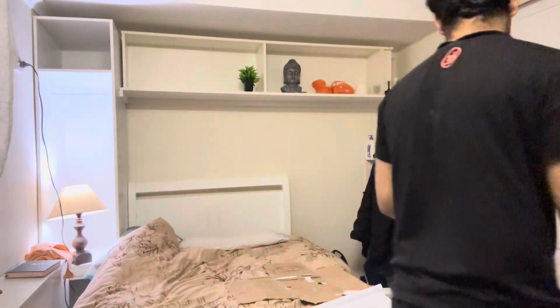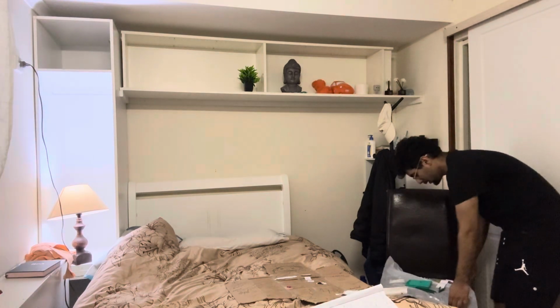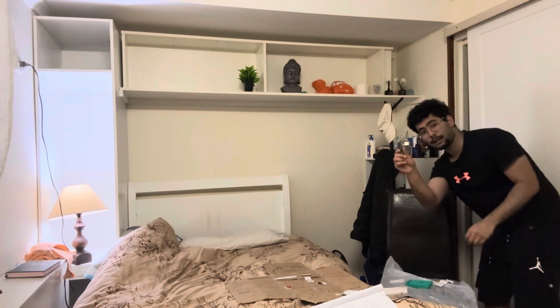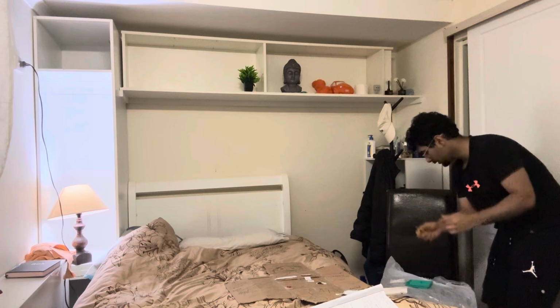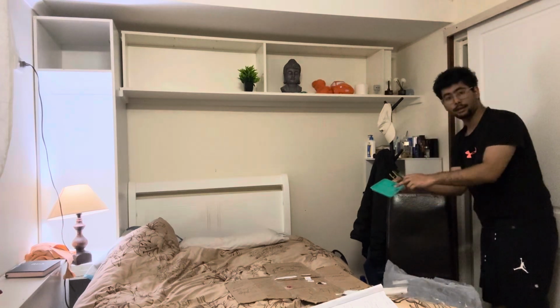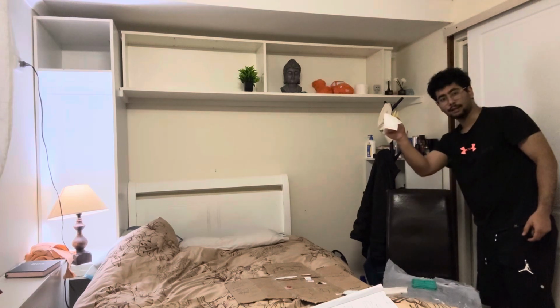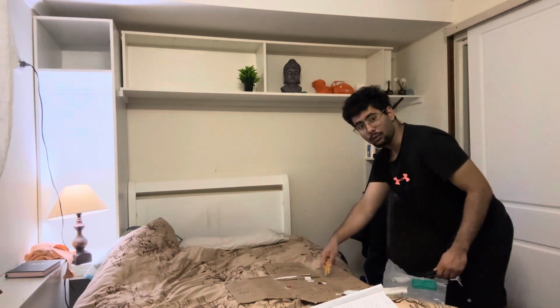I can show you here if you are able to see. So it's a dressing pack right here, and then all the forceps part here. As you can see, these are the forceps, these are like the tongs, right? And this is the main thing where we put the saline, and these are the gauze, these are the cotton balls. So we dip it in here, and then we clean the wound.